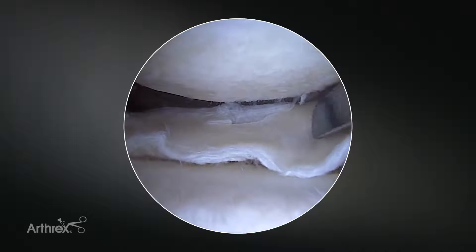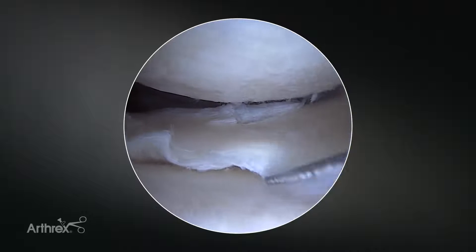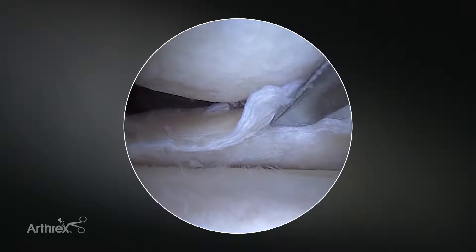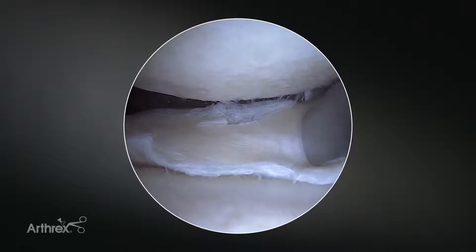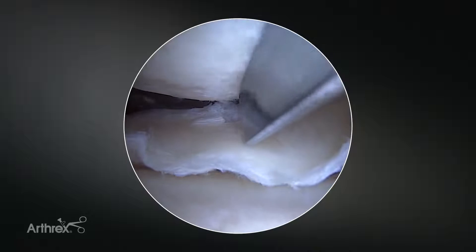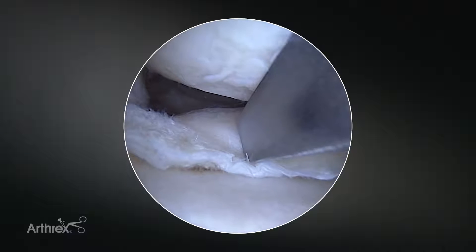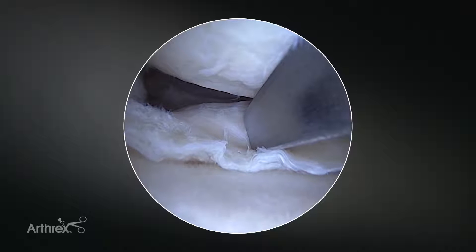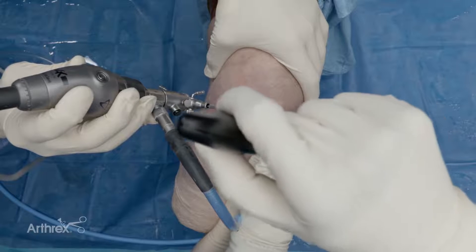We're going to start typically on the femoral side, because the meniscal tissue can be quite mobile at this point and it tends to be more difficult to puncture the tibial side as your initial stitch. I usually start on the femoral side. I place my stitches sequentially, starting more peripherally and then going more centrally towards the root, mainly because it allows the sled to protect the previously placed sutures and not get them entangled with the subsequent stitch. We'll come in now with our first implant.